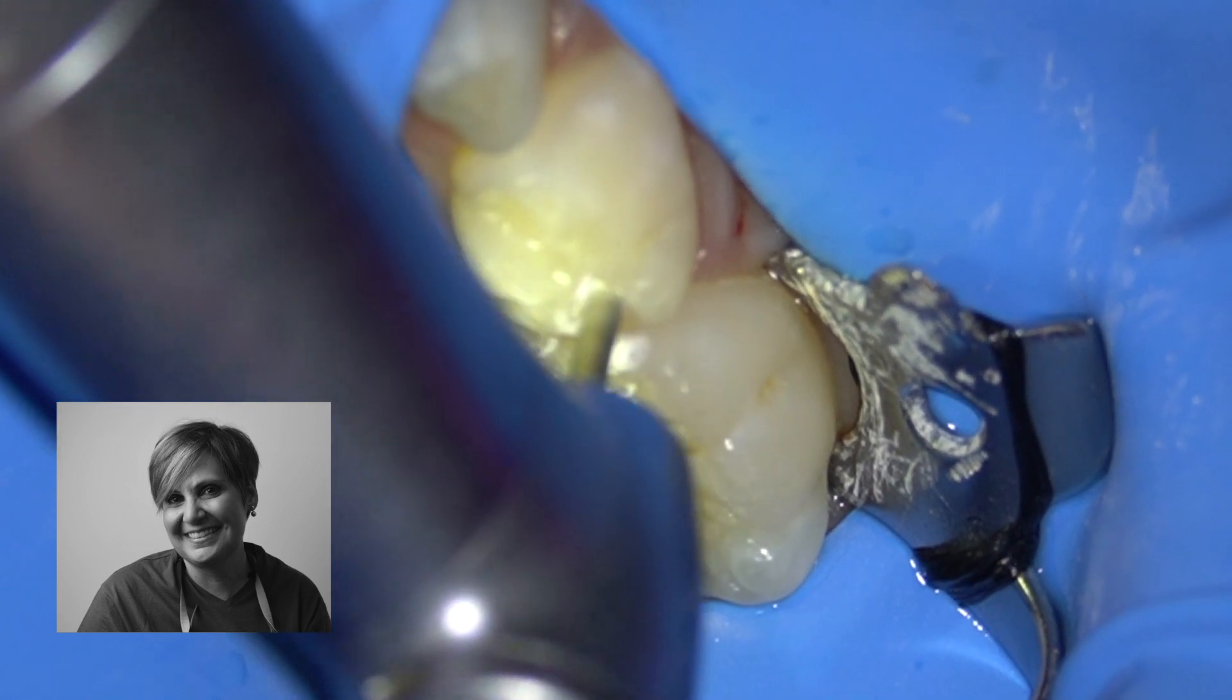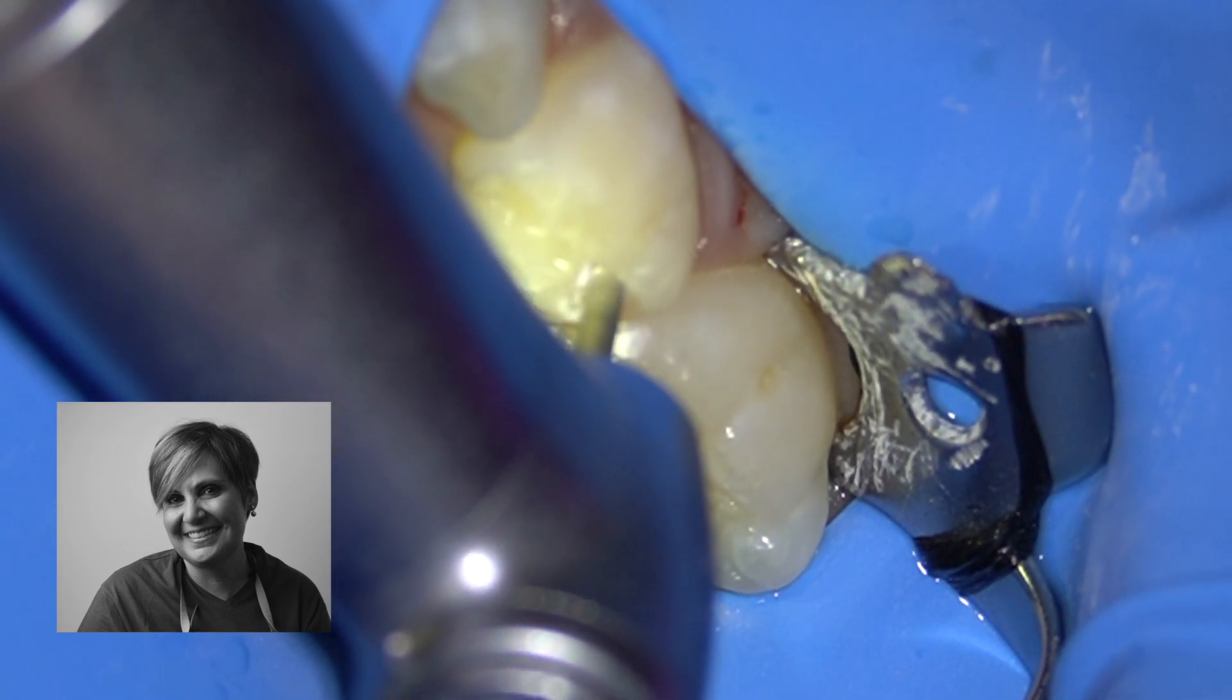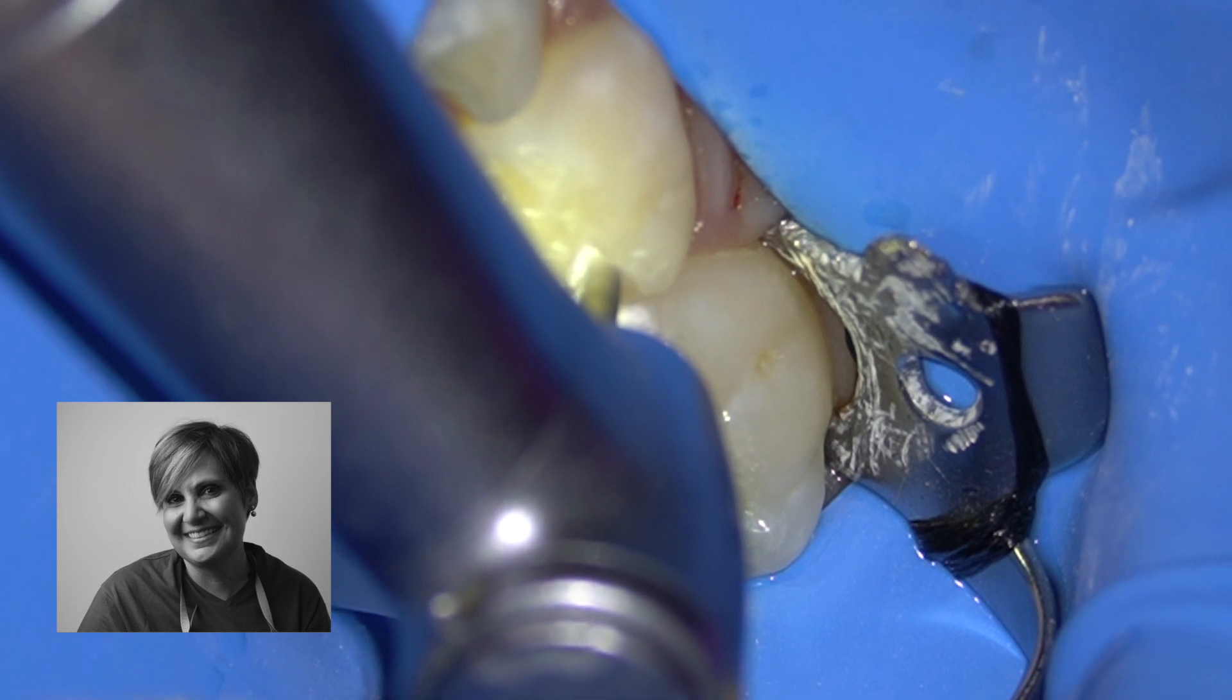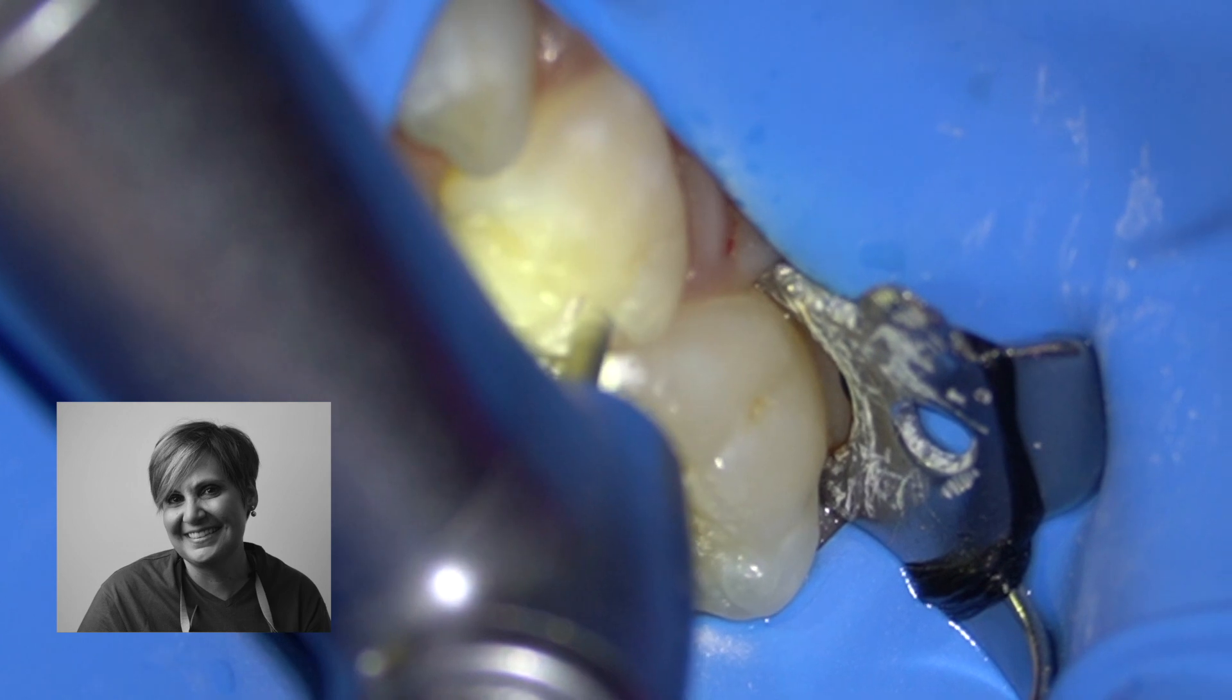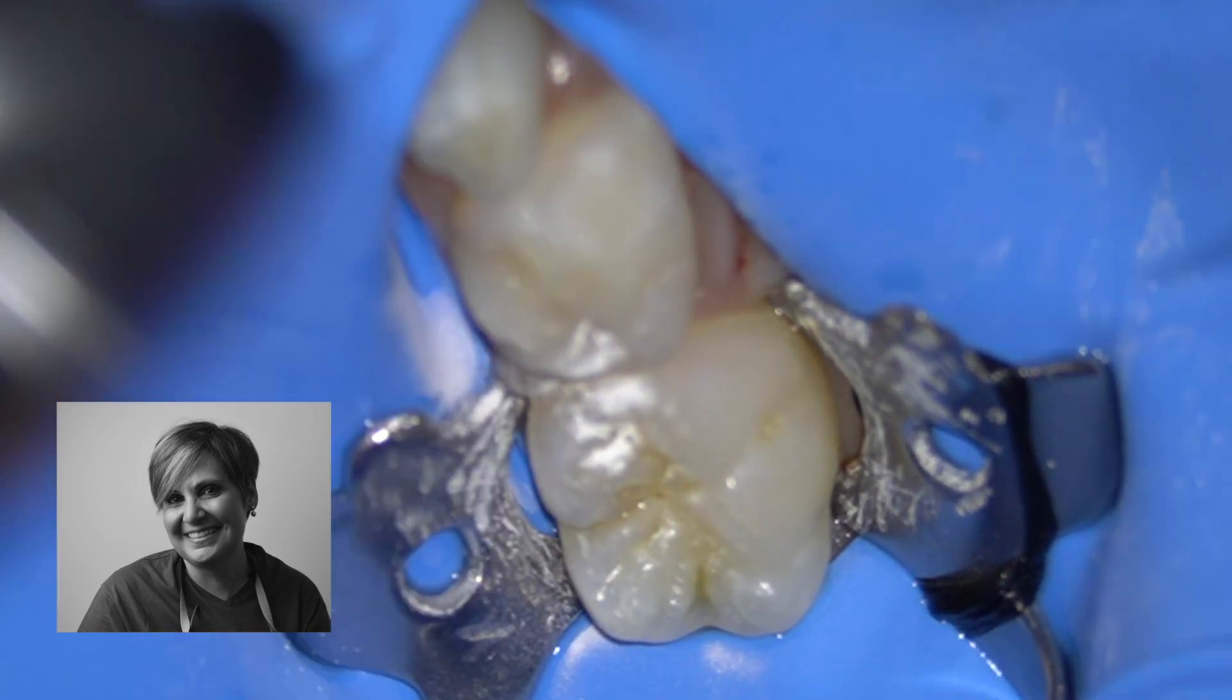You see that with a no-name bur there are more vibrations and a lot of effort and we don't have a deep cut.